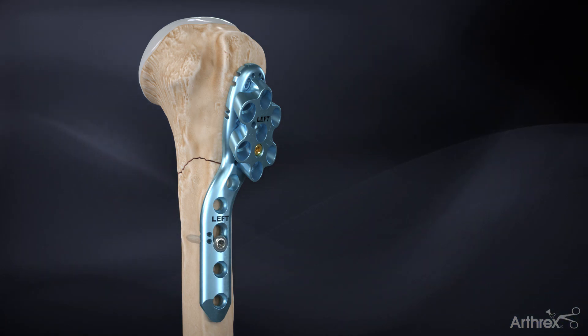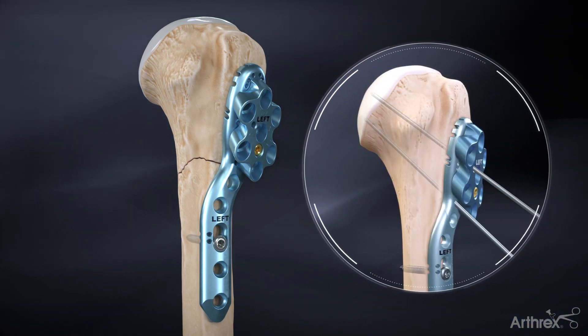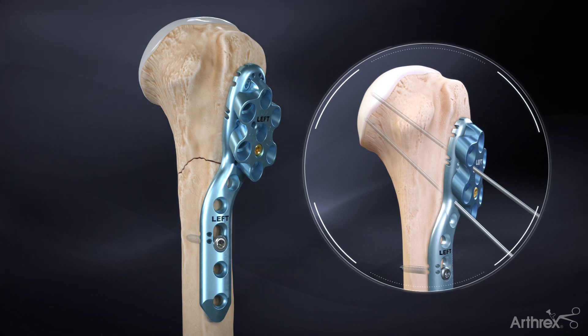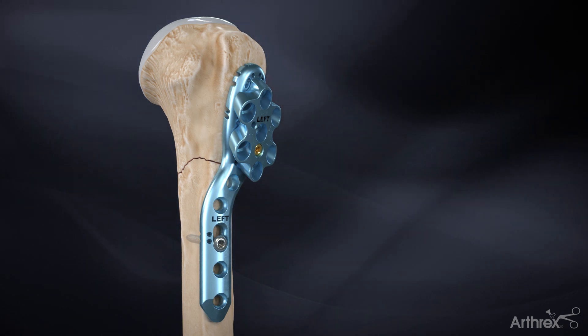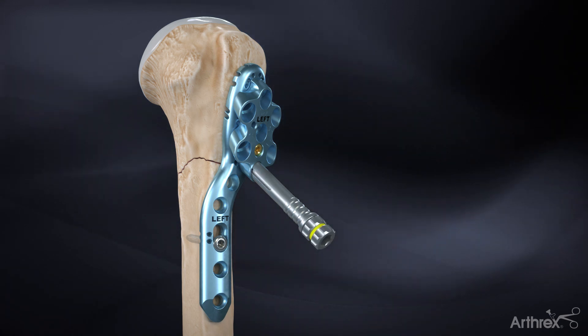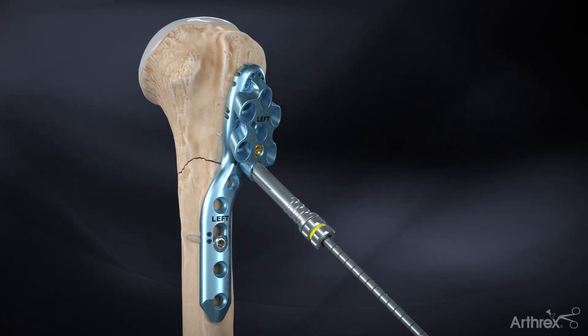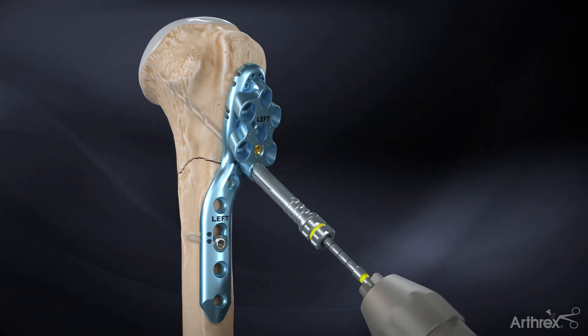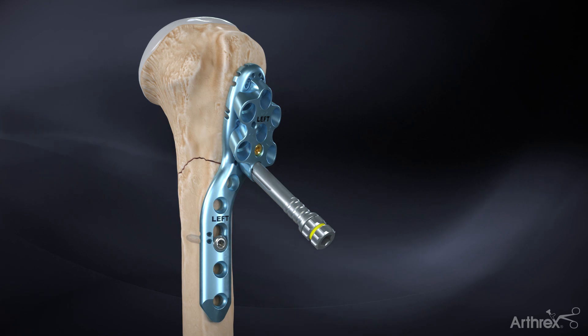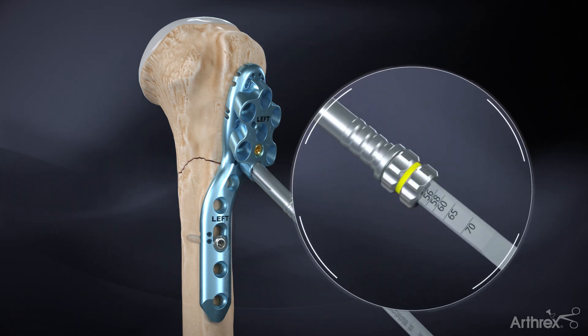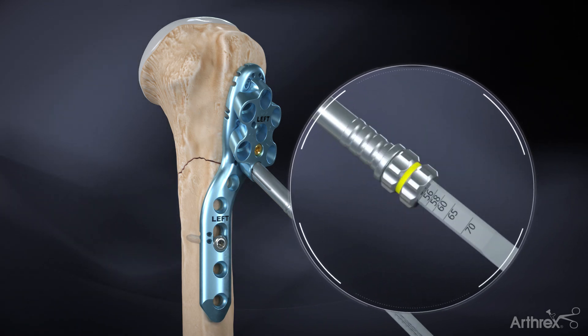Verify the proximal screw trajectory by inserting K-wires through the aiming block and verifying using fluoroscopy. Insert the screw sheath into the alignment guide followed by the 3.5 millimeter drill guide. Advance the 3.5 millimeter step drill through the sleeve until the drill tip reaches subchondral bone. Using the depth guide, measure to determine the desired screw length to be inserted.